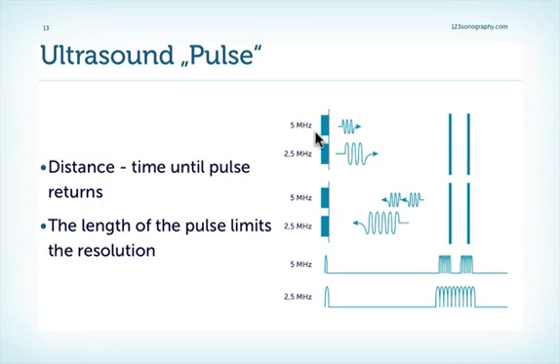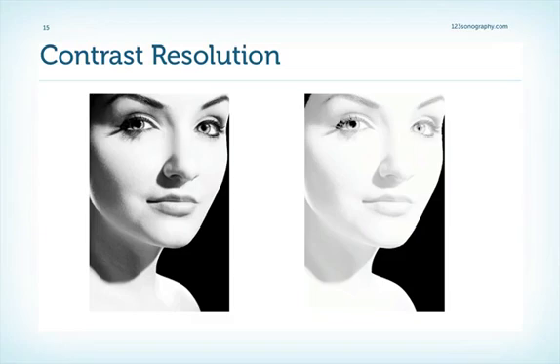And remember, the shorter the intervals between the pulses is, the more rapidly we can fire one beam after the other, and therefore we also enhance the lateral resolution. So you can already see that there's a very strong interplay between many different factors in ultrasound. The pulse width, the pulse frequency, the imaging frequency, the lateral resolution, the resolution altogether, and also, of course, the frame rate.